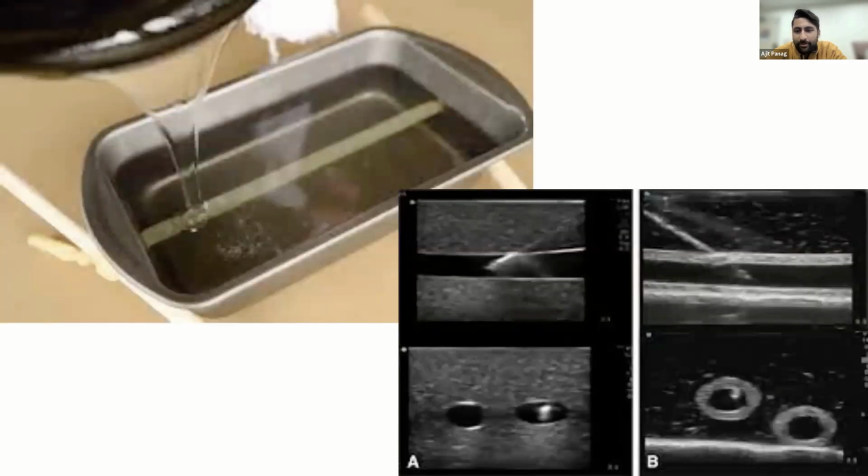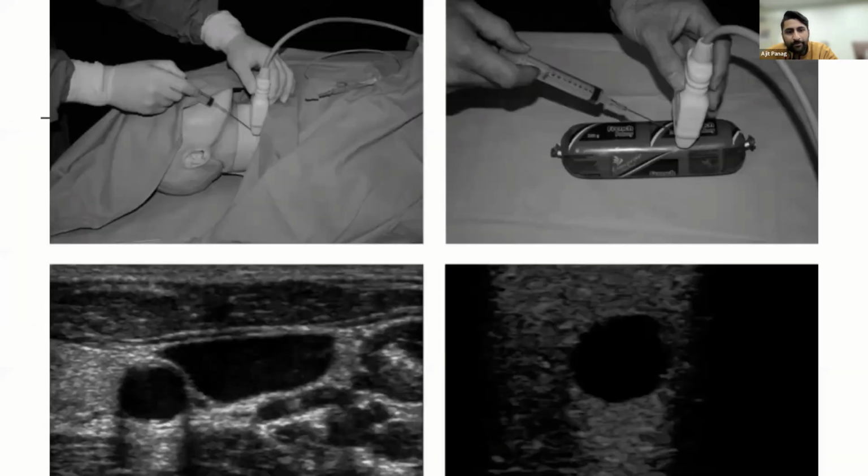If you just type in ultrasound homemade model on YouTube, you'll find countless examples of how to make these. This is somebody making a ballistics gel at home in a cake pan, and you can see what it looks like on the right. So, not so bad. These are limited sometimes because once you pop that balloon or glove, the latex structure tends to lose its value pretty quickly. They're best used for the first 5 or 10 passes. But they are cheap and easy to make.